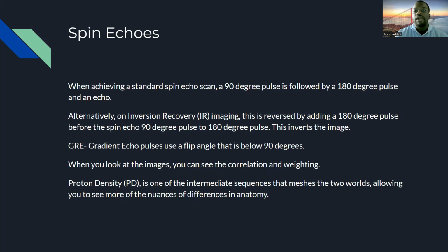It'll be less than the standard 90 degrees, that standard perpendicular line that I mentioned, creating a different precessional frequency with those protons and resulting in different imaging. They also interact with the different planes I mentioned. You have the long plane of the body of the magnet, then you have that perpendicular plane, and then you have that cross-sectional plane. So there are three planes.